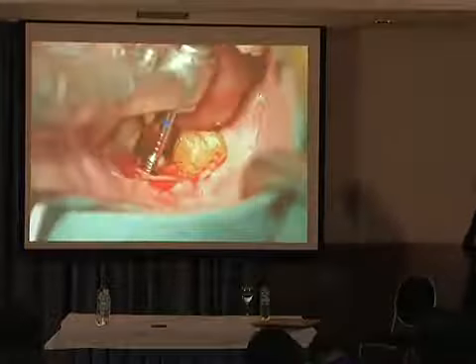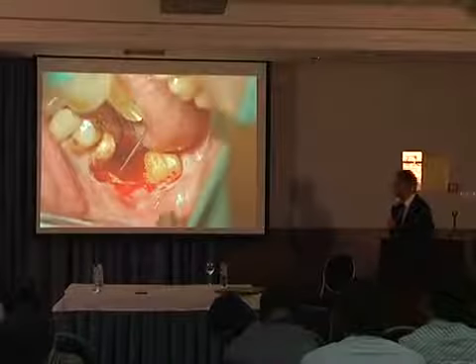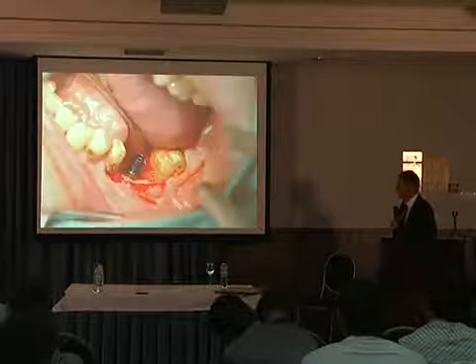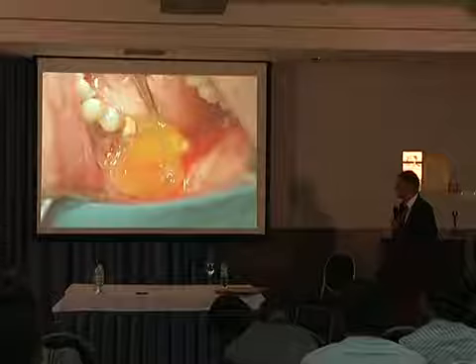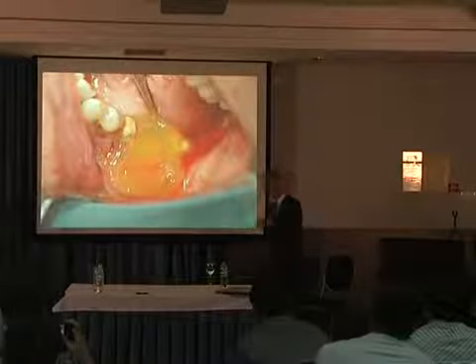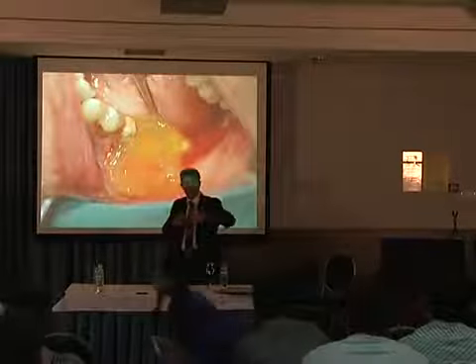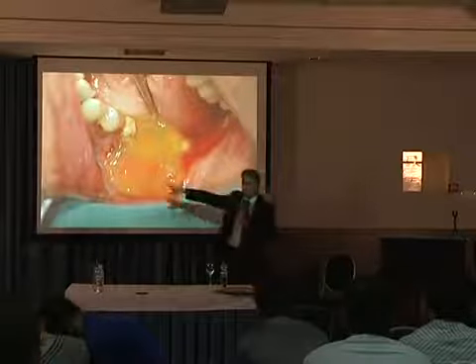Okay, no perforation. We go ahead. Thread cutter. PRGF. Membrane. The implant is placed. We measured again to check whether we have 1.5 millimeters there. Even without augmentation, we use the PRGF growth factors on the surface for more bone implant contact, as Dr. Eva showed us, and always this for the soft tissue healing.